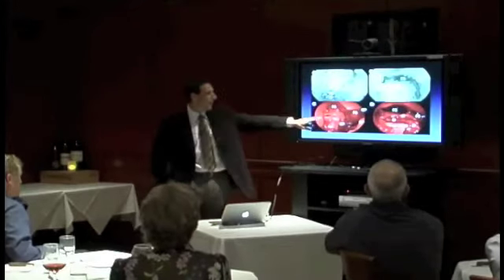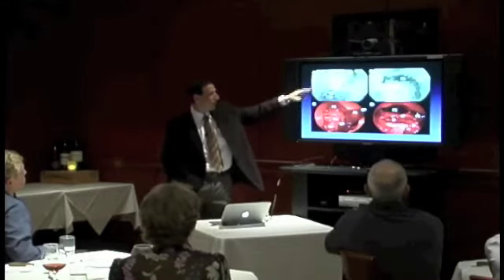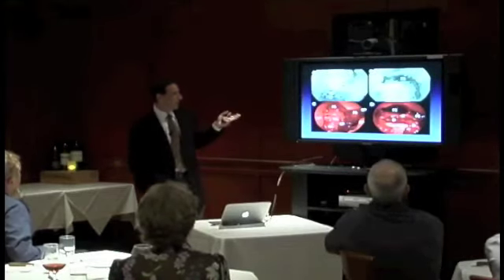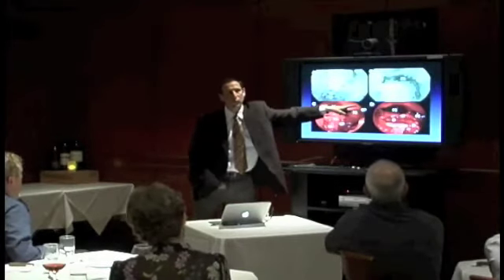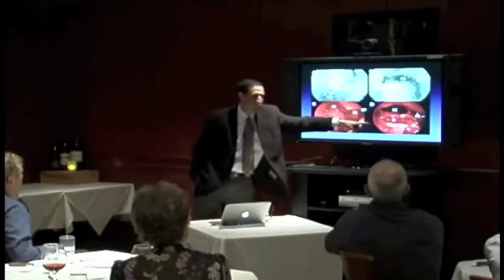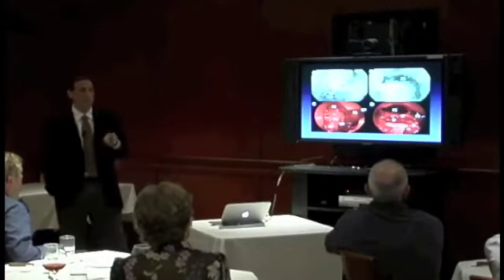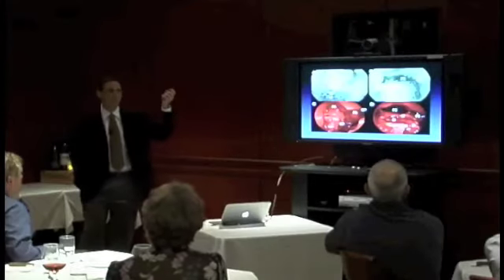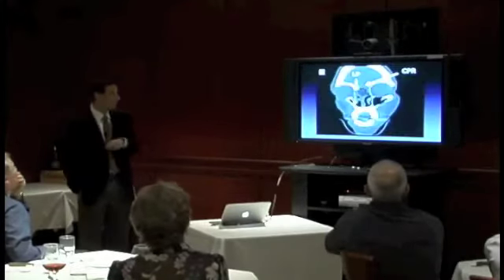And so right here is the actual surgical case, and you actually can see the tumor where it's obstructing the outlet to the frontal sinuses. We remove the tumor, and once we're done, here again, we now are seeing a wide open frontal sinus. Here's the dura of the anterior cranial fossa. When you do this, you might get a little bit of spinal fluid leakage, but again, you just put the glues and the replacement tissues there, and these people seal up just fine.